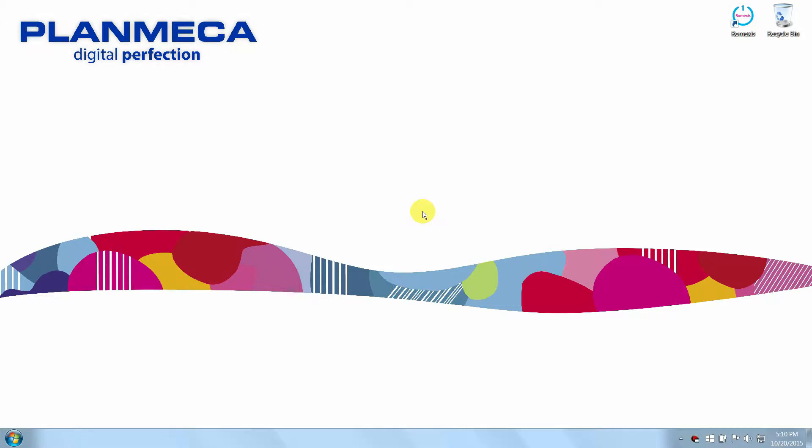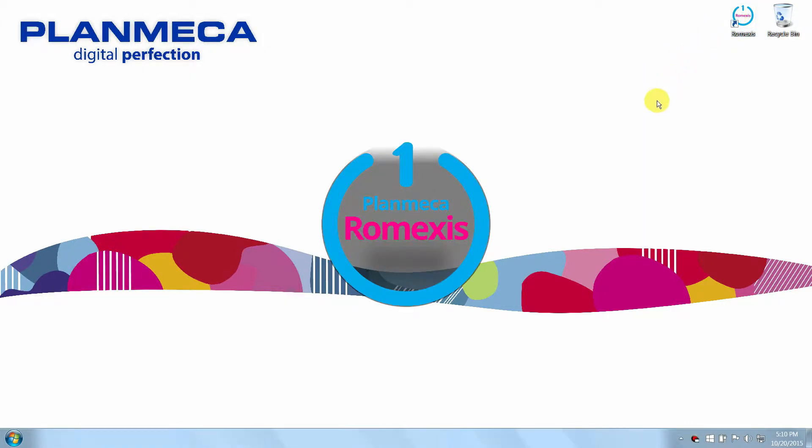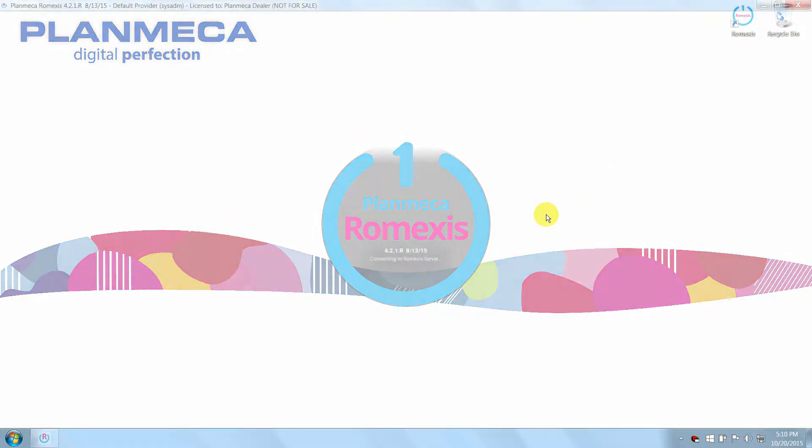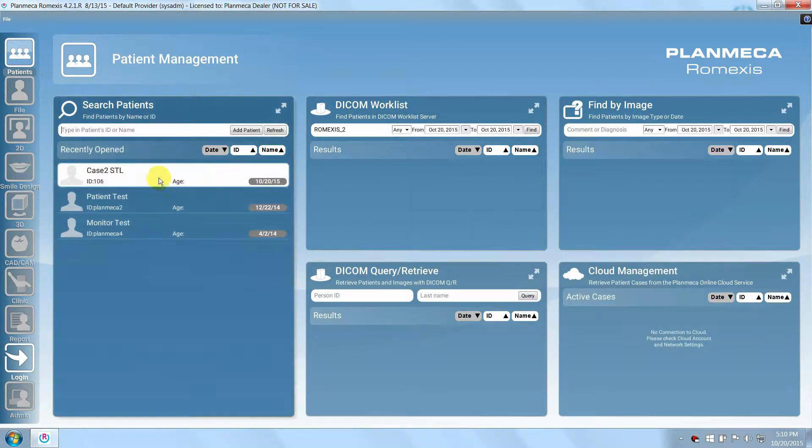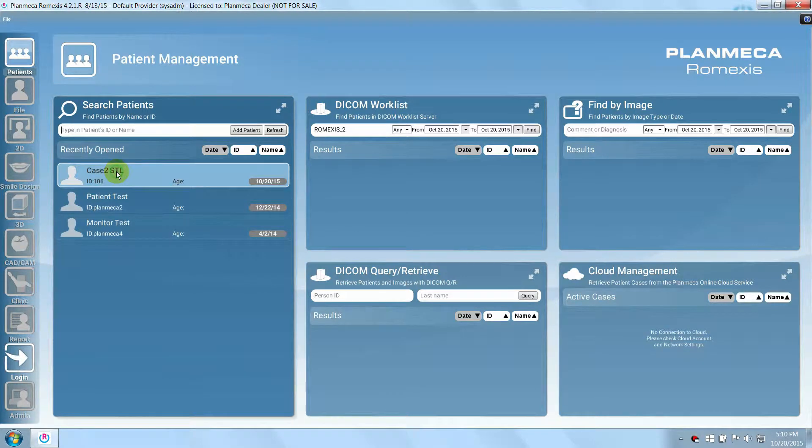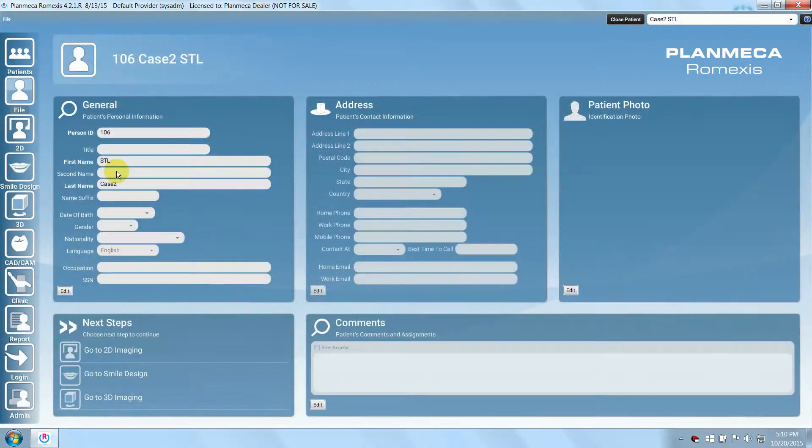You can order surgical guides and radiology reports with 3D-DX directly through Planmeca Romexis. First start Romexis, then open the case that has the implant plan that you wish to order a surgical guide or radiology report for.